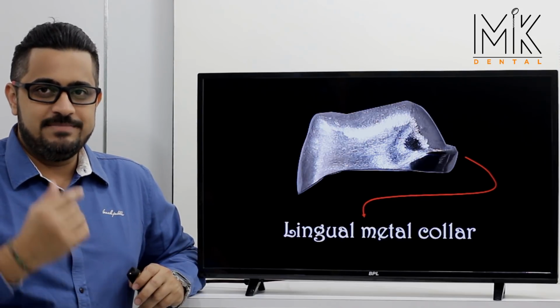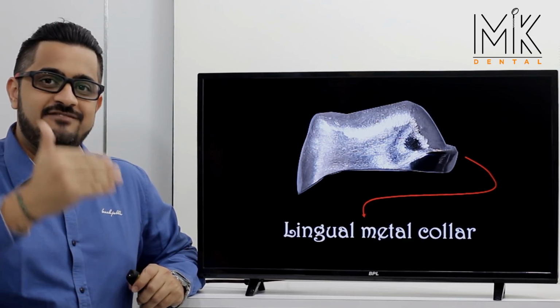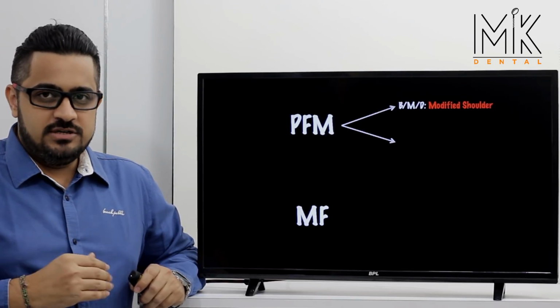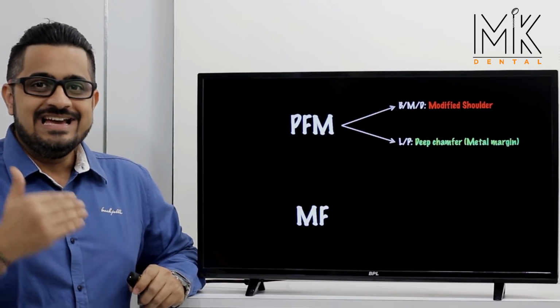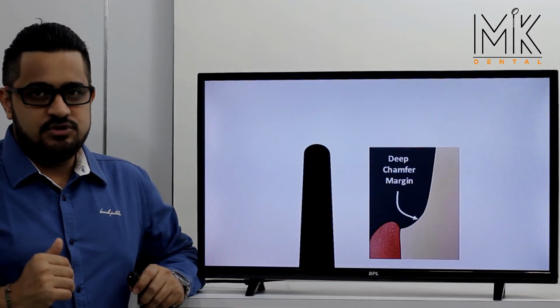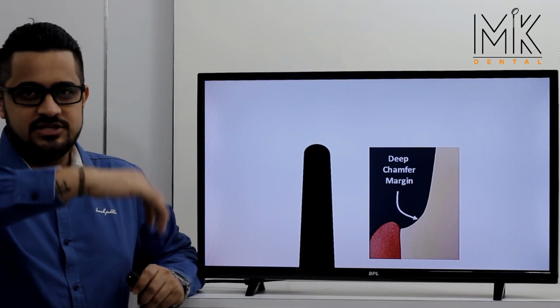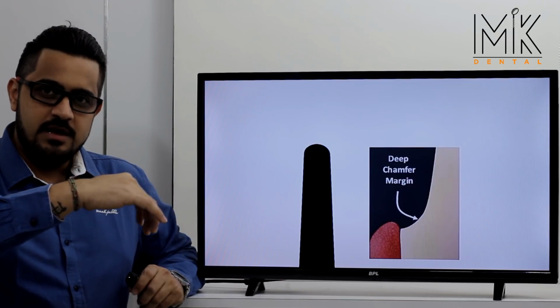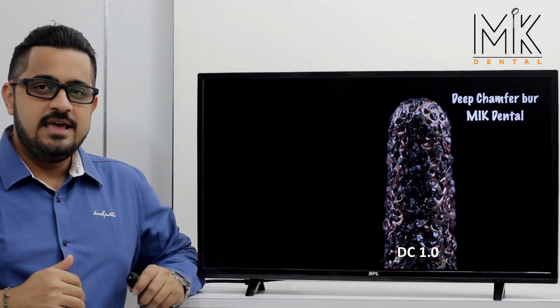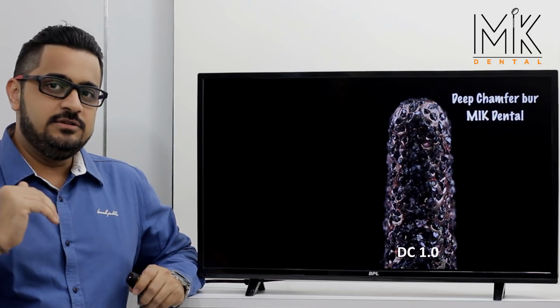This is simply because a metal margin does not require as much reduction as a margin where metal is layered with ceramic. So the lingual or the palatal margin in a PFM classically, friends, is a deep chamfer margin. What I want all of you to appreciate here is how the tip is just a half moon or crescent shape. What's important to understand in this half moon or crescent shaped burr is that the tip of this burr, friends, should only be sunken half depth into the tooth.